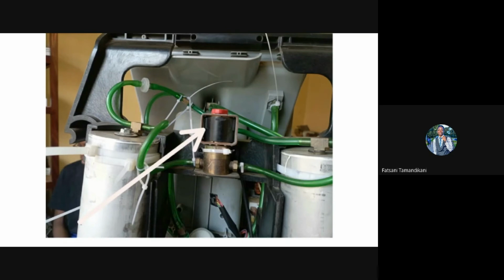In some other models of concentrators, for example the J5, there's no equalization valve. The process of equalization between the sieve beds is done via tubings that are connected between the sieve beds, and inside the tubings there are orifices that help in the purging process.